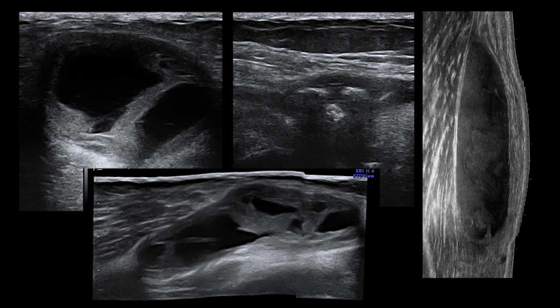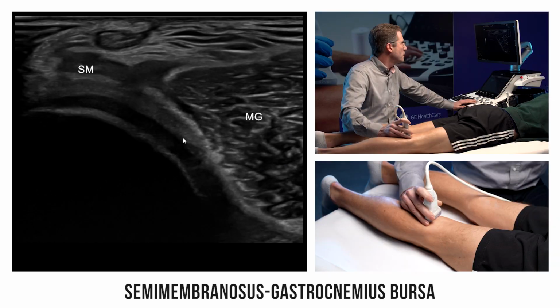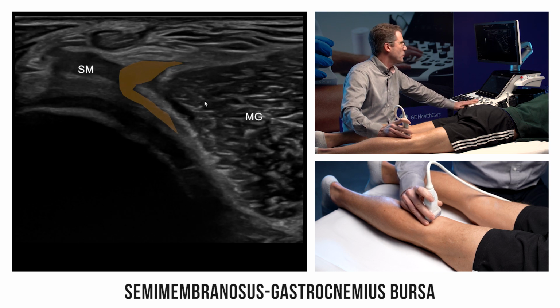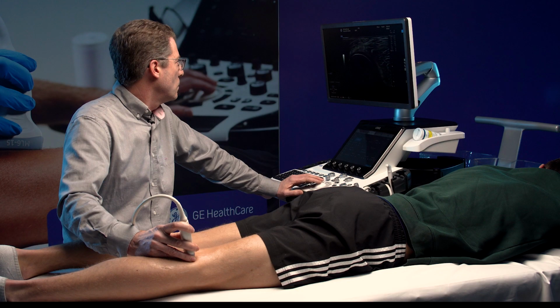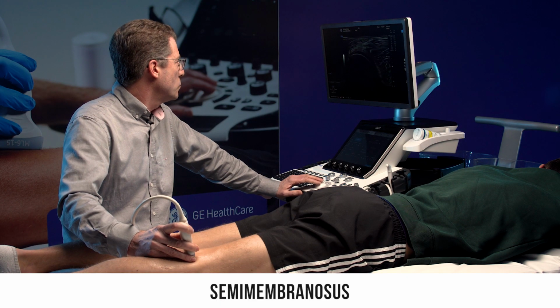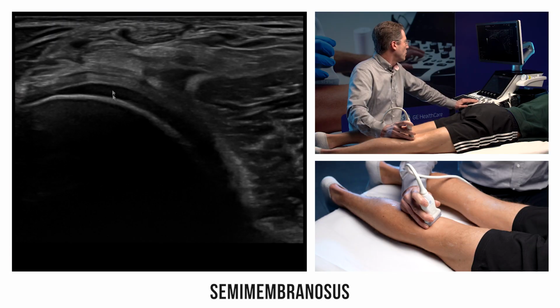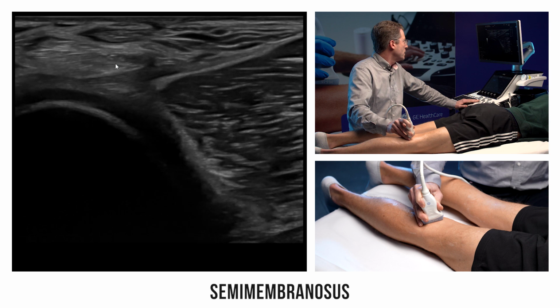The symptoms are very obvious, bringing with it the fear of deep vein thrombosis. As you can see, these popliteal cysts can have various shapes. Nevertheless, they always originate from this common bursa, at the interface between the medial gastrocnemius and the semimembranosus. We continue our analysis by looking at the direct arm of the semimembranosus tendon. It's easy to find, on an axial view, in front of the condylar cartilage.